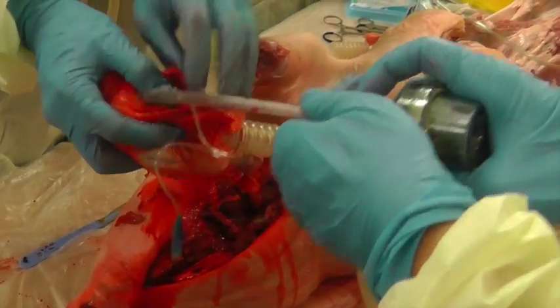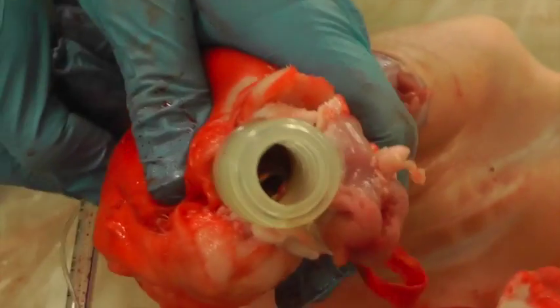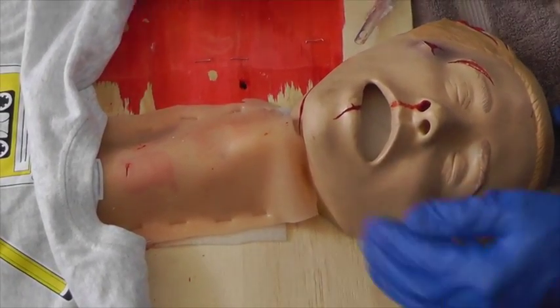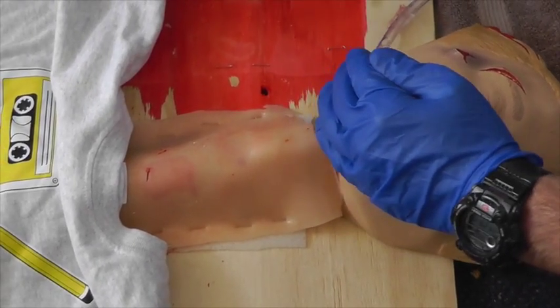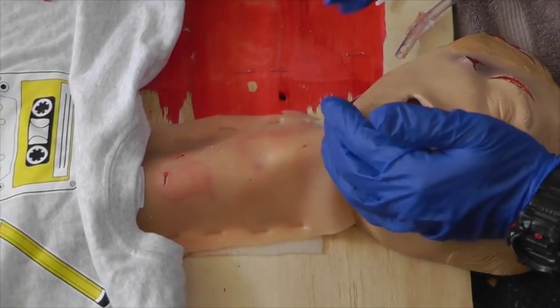Confirm that tube placement — which is in the trachea. It's a good model. It's a can't oxygenate, can't ventilate scenario. Maximize head extension, chin back.